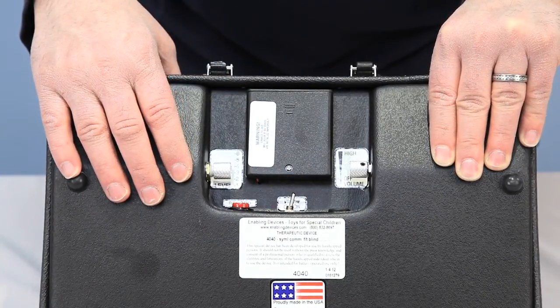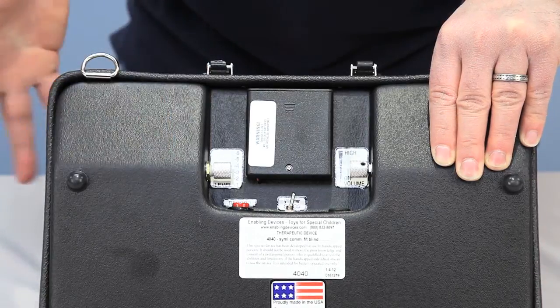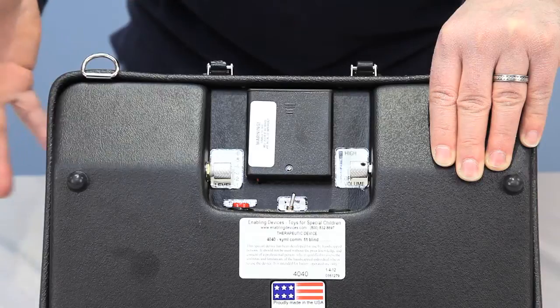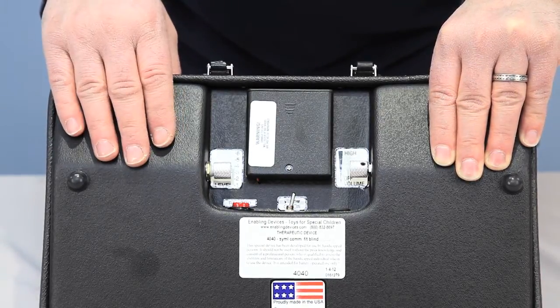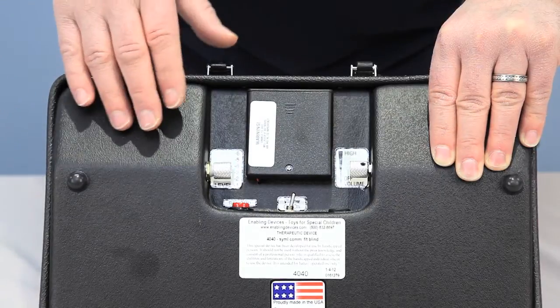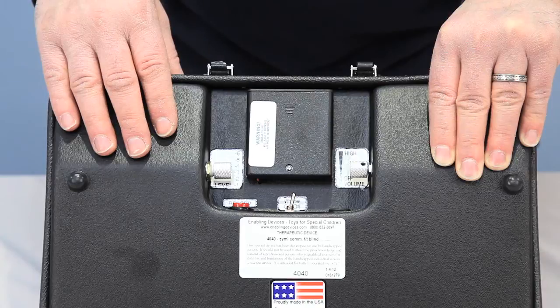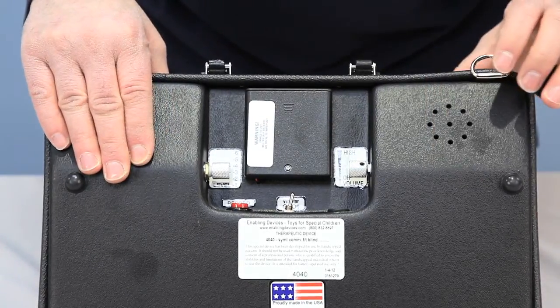There's also a toggle switch that turns vibration mode on or off. When set to vibration, as a message plays back the user will feel tactile vibration in addition to the tactile symbol, giving additional feedback so they know they're activating a message. This is especially useful for someone who is not only visually impaired but also hearing impaired.